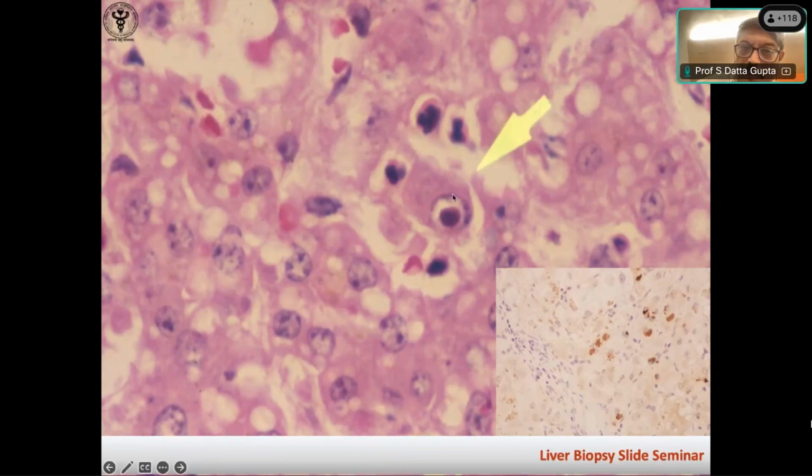Okay, so please be careful of these things, right? You see this, and you're finding polymorph, polymorph, polymorph here. In CMV, you generally find polymorphs, right? You see this. Generally, if more than 50 or 75% of the area it occupies, you can be rest assured it's an intranuclear viral inclusion, mainly CMV, right?